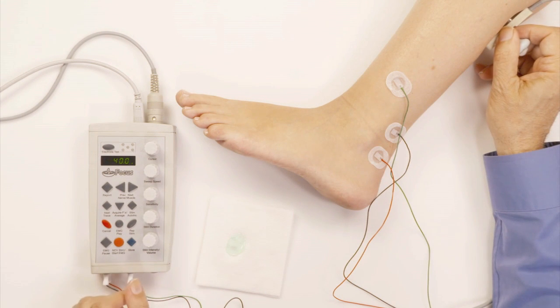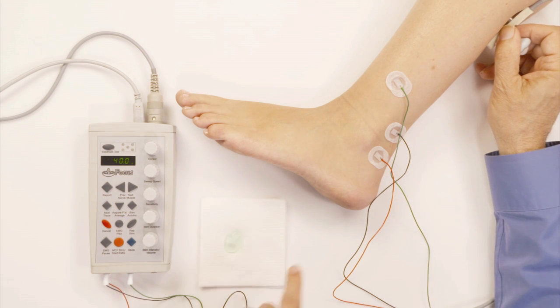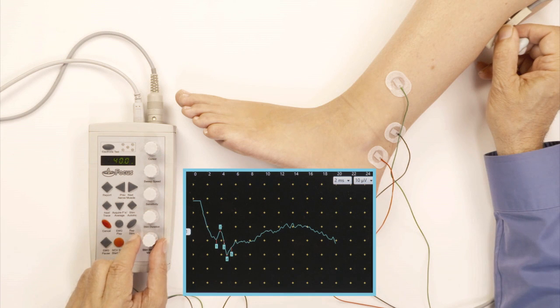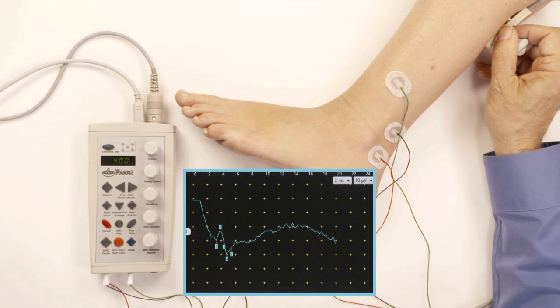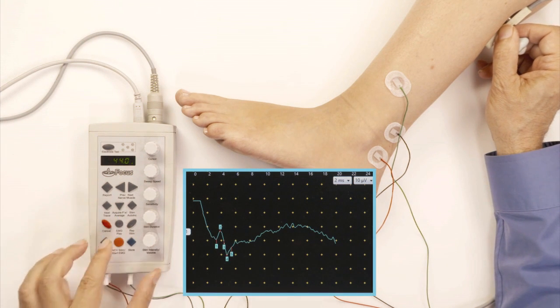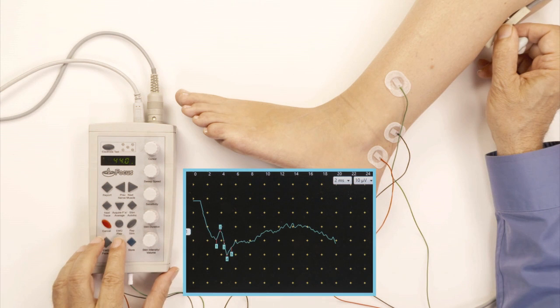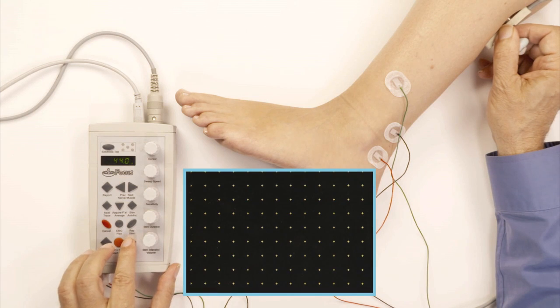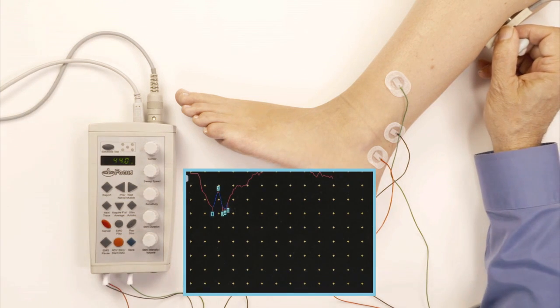I start stimulating and increase the intensity enough to get a good response. My first instinct is to ask the subject if they feel it going down to their ankle — she confirmed that she did, which tells me I'm over the sural nerve. It's sometimes tough to relax in this area, so you might not get a perfectly straight baseline, but I can see the sural nerve potential fairly clearly. I raise the intensity a bit to get a higher amplitude, and now I've got a good sural nerve response, so I accept and save it.